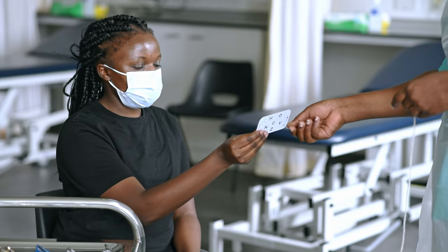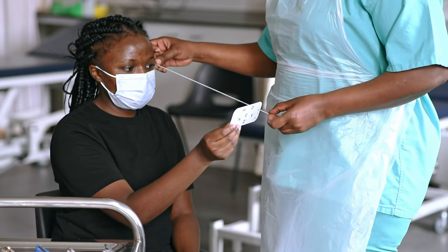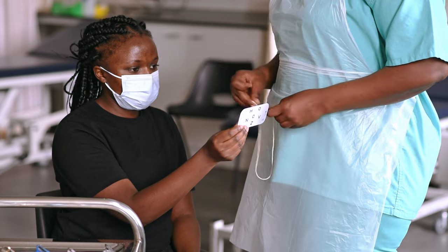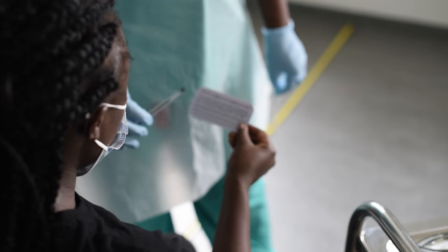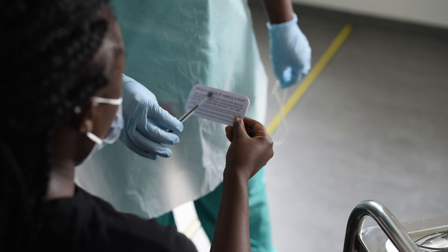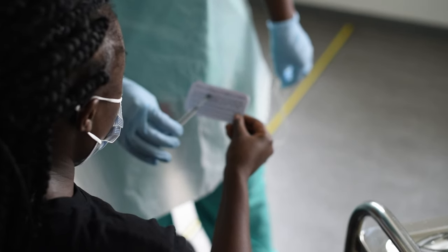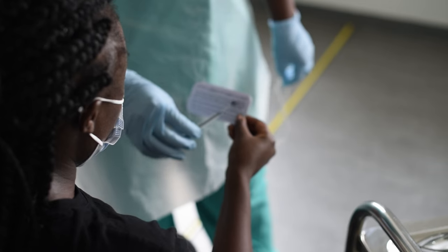Now test near visual acuity. Ask the patient to hold the chart 40cm away at a typical reading angle. If they own reading glasses, test with them on. If not, then test unaided. Ask them to keep both eyes open this time. Explain that you want them to read out loud, starting with the biggest letters at the top of the chart.